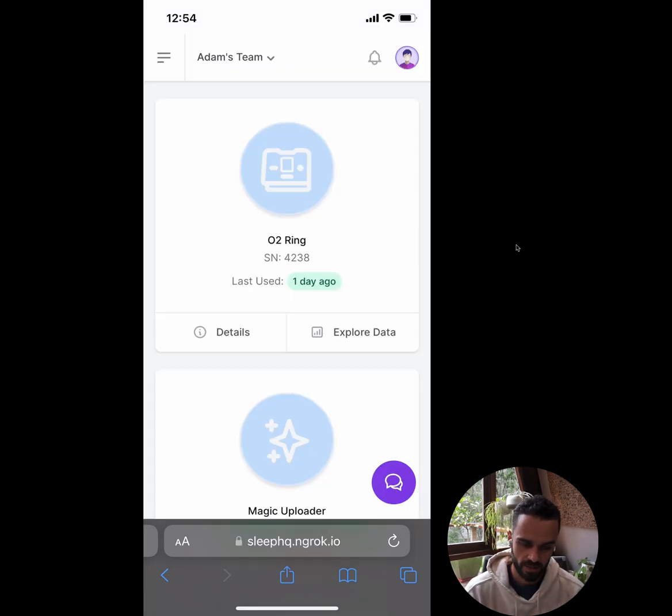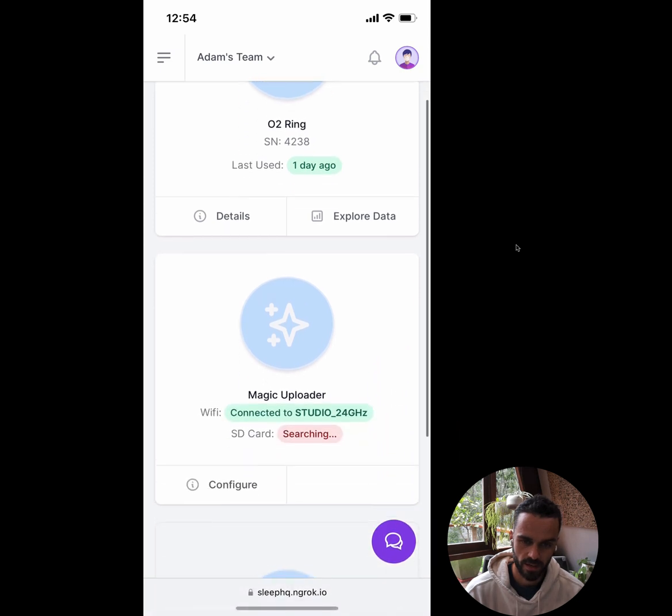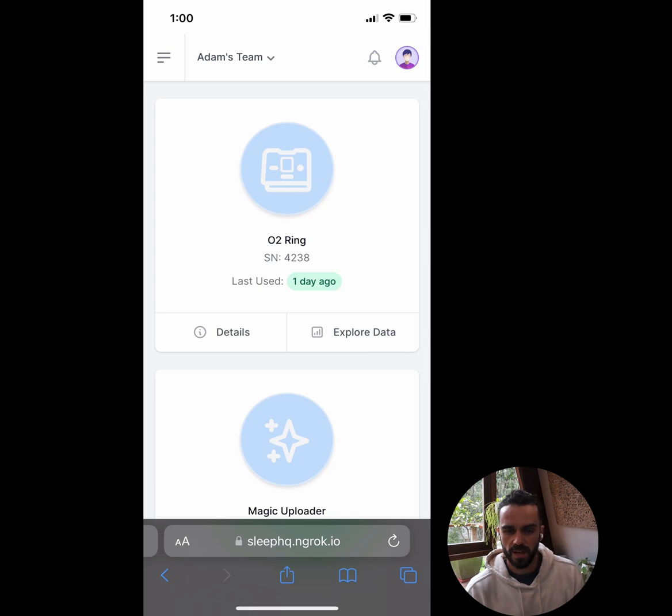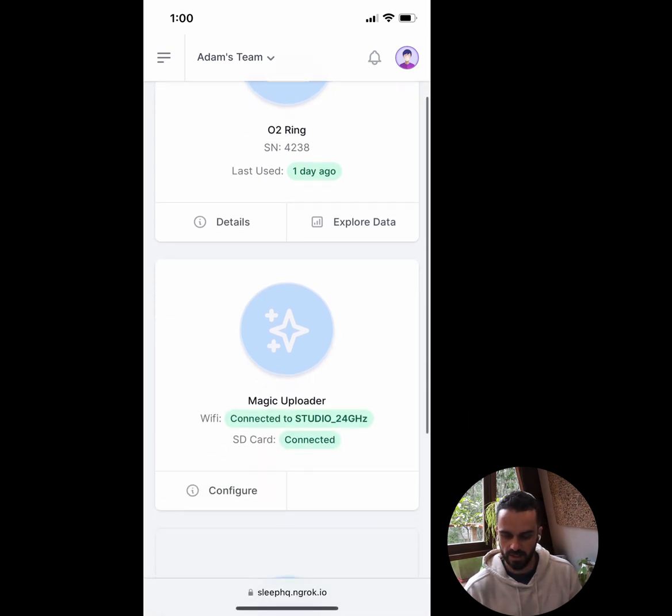That's redirected me back into SleepHQ and I'm on the My Devices page again. I've still got my O2 Ring up the top, and if I scroll down I now have my Magic Uploader appearing underneath. Under WiFi it says it's connected to 'Studio 24' — that's the WiFi network we connected it to. Under SD card it says 'searching,' so I've just put the SD card in and we'll give it a minute. After a couple of minutes, the Magic Uploader now shows connected to WiFi 'Studio 24' and the SD card — everything is wired up and working correctly.